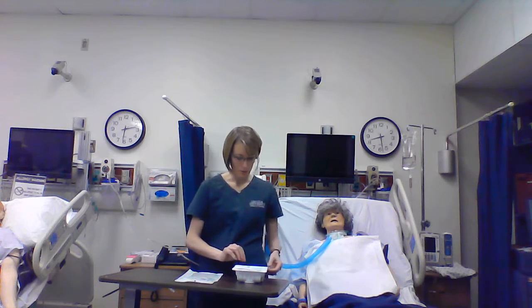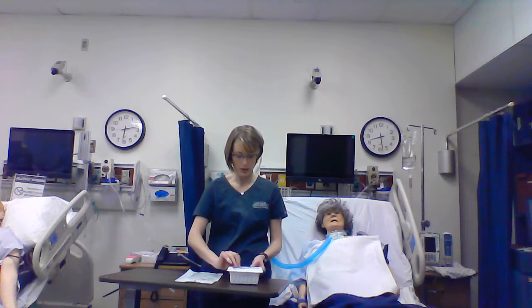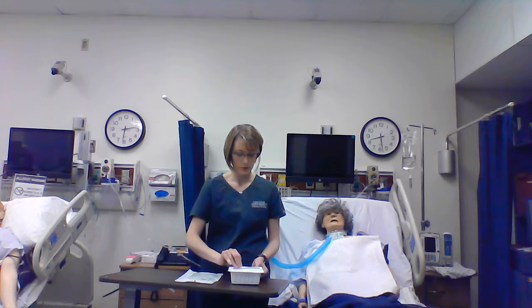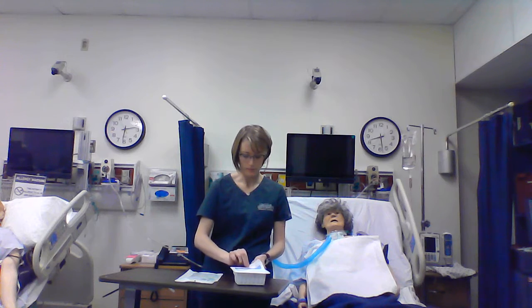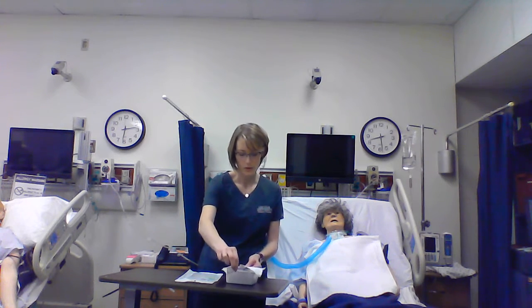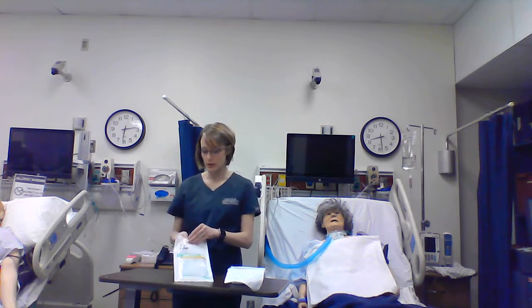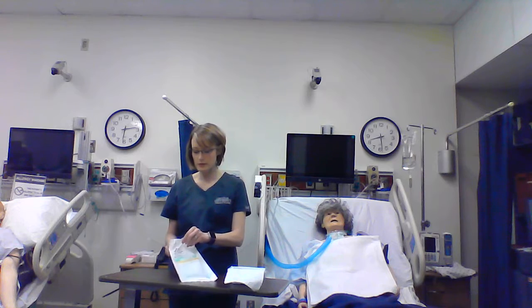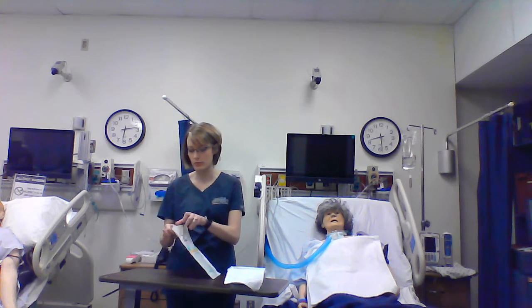I'm going to go ahead and open my tracheostomy catheter, the suction tray, which is a sterile tray, opening it away from me. And then I want to open my sterile gloves. These kits come with sterile gloves, but I don't typically fit into them, so I usually bring a couple pairs into the room.